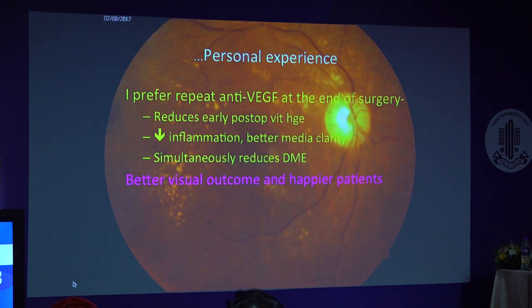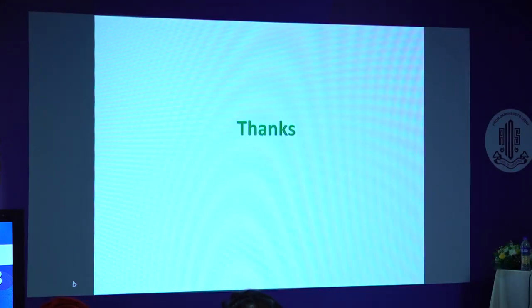So in the end, I also prefer repeat anti-VEGF at the end of surgery, as it reduces early post-op vitreous hemorrhage, reduces inflammation, gives better media clarity, reduces DME, and gives better visual outcome with happier patients. So, thanks.